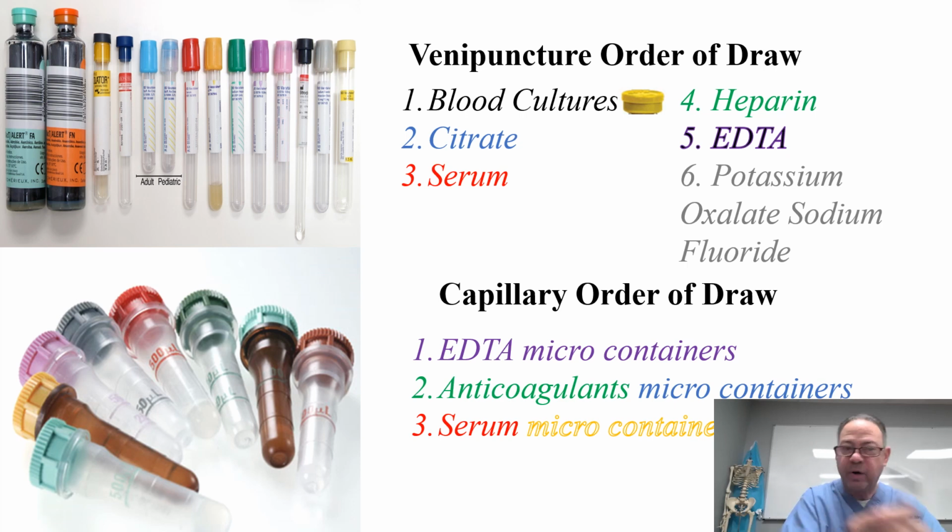with this here. So for example, many people, okay, don't follow, because doctors don't know, nurses don't know, and many medical assistants don't know either. They don't follow the order of draw. Like for example, this tube here that I'm gonna show you later on too, we use it for routine chemistry, let's say potassium. Vamos a decir que vamos a saber el nivel de potasio del paciente. Usamos este tubito que está aquí.